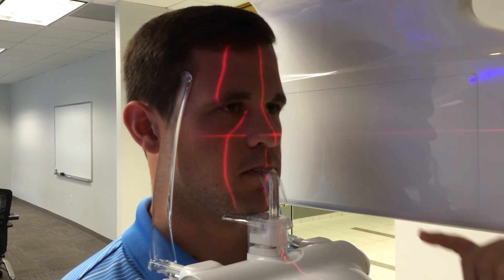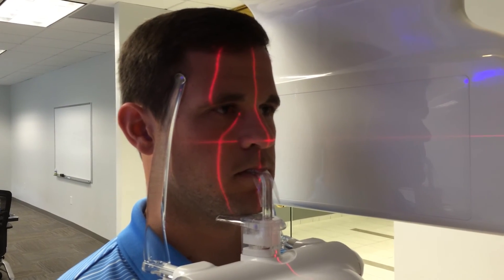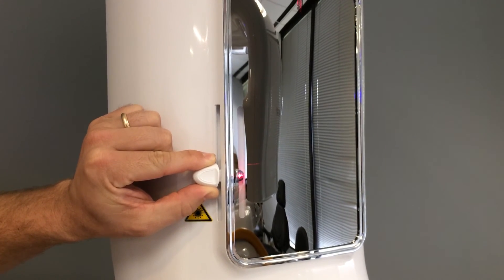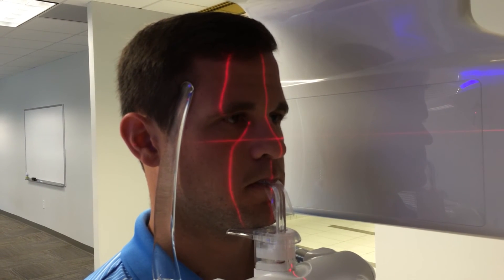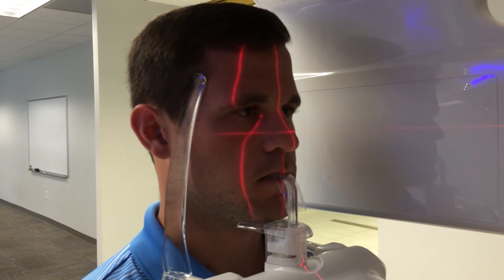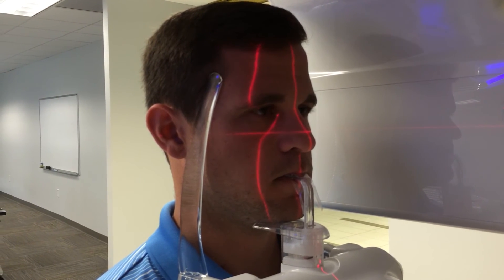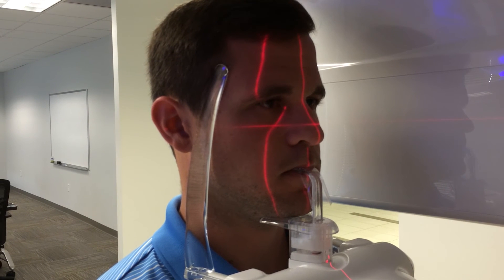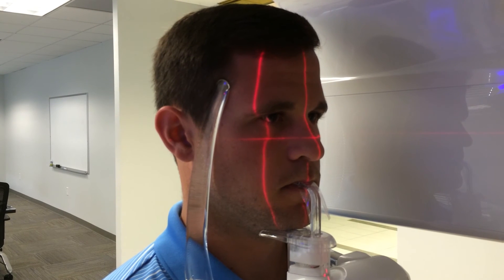The next laser is the Frankfurt horizontal plane laser, adjusted using the slider piece by the mirror in front of the patient. It should line up from the bottom of the orbital socket to the tragus of the ear. If it's not aligning correctly, have the patient keep their chin on the chin rest and stand up straight, then lower the machine slightly — letting the chin drop down — until the laser lines up correctly.